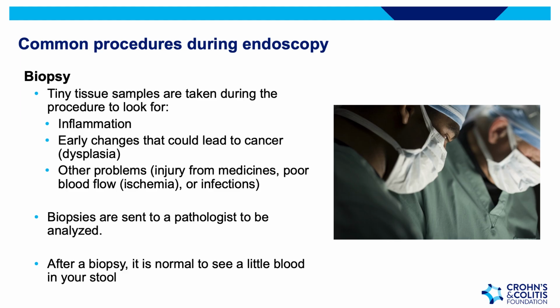After a biopsy, you may see a little bit of blood in your stool. If it continues for multiple days after the procedure, you should contact your doctor just to ask if this is still normal.